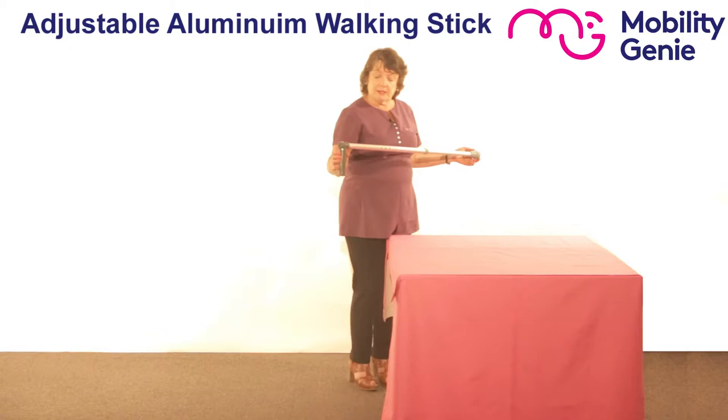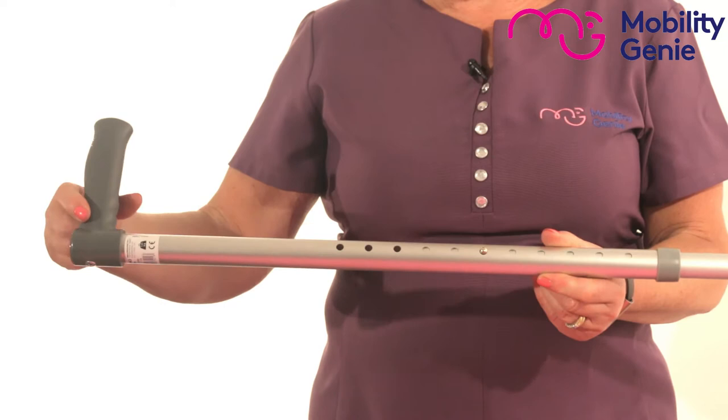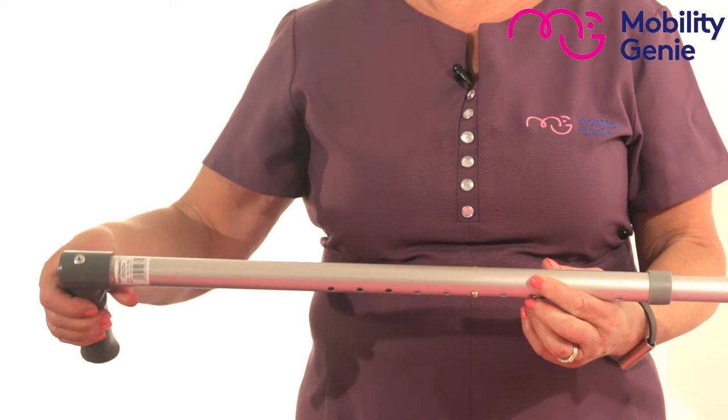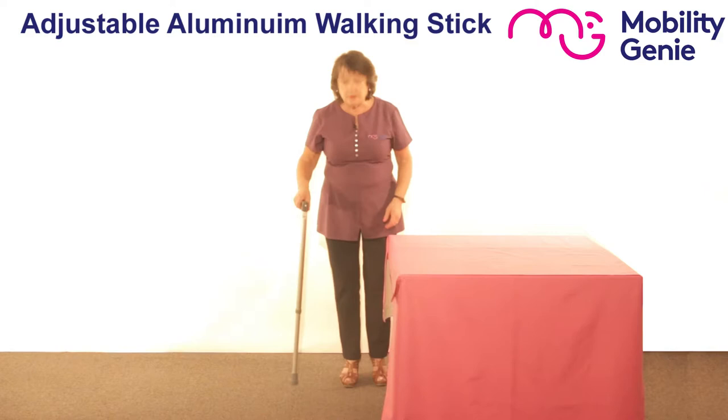You can see here that it's got a straight comfort handle. You've got holes above and below this button, and you've got a corresponding button. The holes allow you to adjust it up or down. And then you have a ferrule that's non-slip that you must remember, as it wears out, you've got to replace to keep you safe.